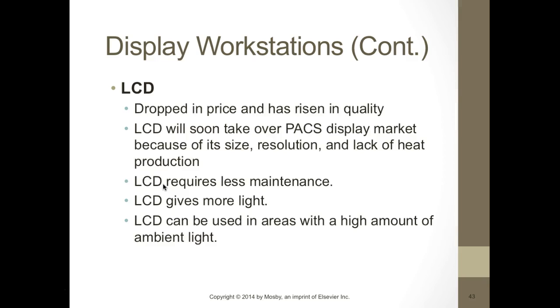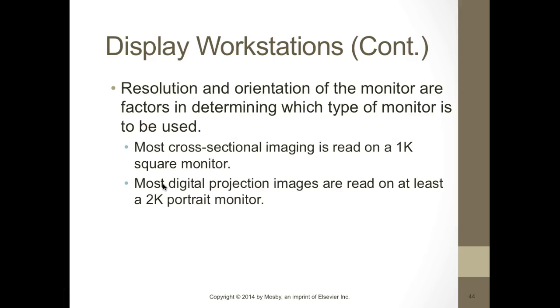The LCD, they've dropped in price and have improved in quality quite a bit. So in most of your departments, you have the LCD monitors because of the size and the resolution and the lack of heat, which is great. They also require less maintenance, and they're able to give off a lot of light. And they are really good when the light in the room is bright. You can still be able to see the image very well.